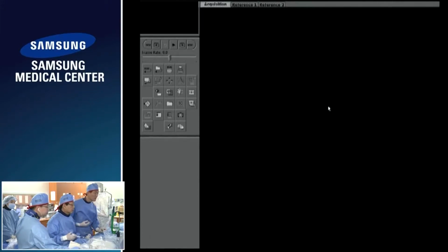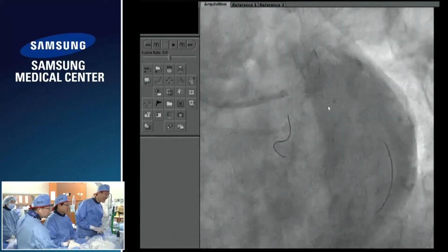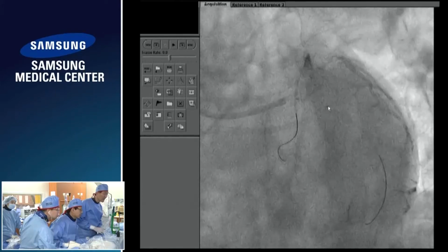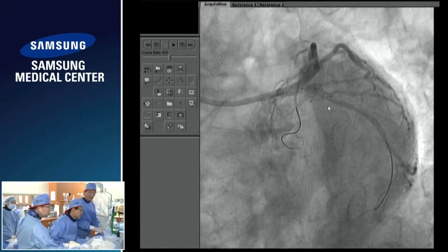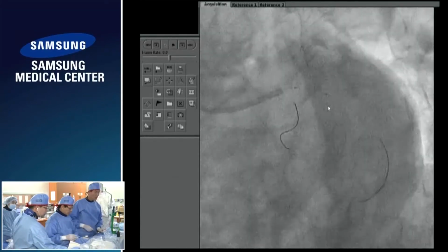Angio. I would prefer it lower. Too deep? Yeah, too low. I would prefer to... Okay, looks okay. Too distal, 1 millimeter more. Slightly more. Too distal, yes. You have to look at the balloon marker, not the platinum marker. The balloon marker is at the end of the stent. Yes, it's here. Okay.